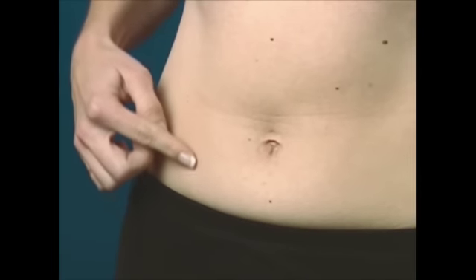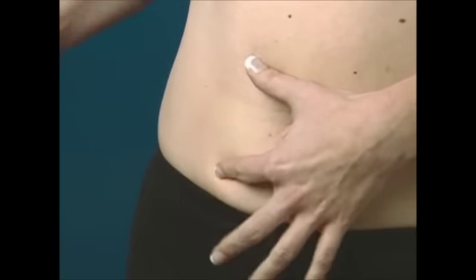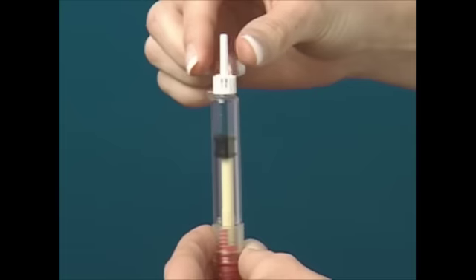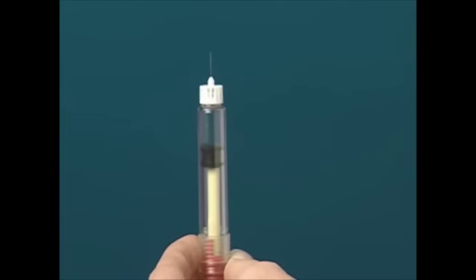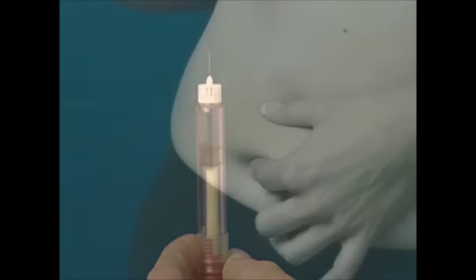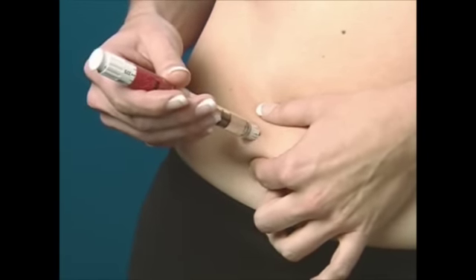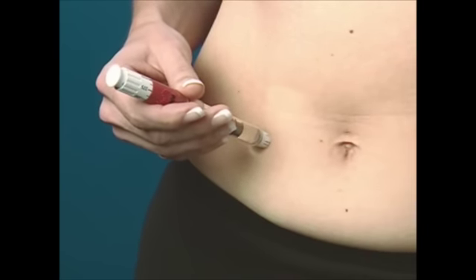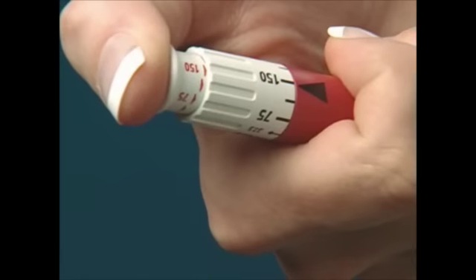Your fertility specialist will have discussed a suitable injection site with you. Clean the recommended injection site with an alcohol swab and let air dry. Remove the inner needle cap. Do not touch the needle or allow it to touch any surface. Hold the pen in one hand and with the other hand, pinch the skin around the injection site. To inject, insert the needle into the skin at a 90 degree angle. Once the needle is inserted, you may release the pinched skin and push the injection button until it stops clicking.